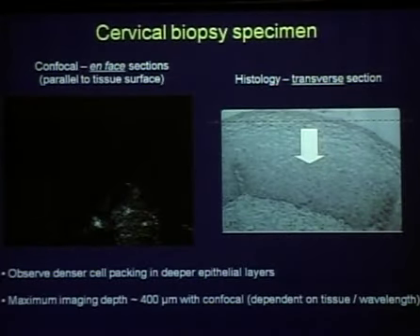Because there's melanin present in the skin, we see this particular pattern of contrast. When we look at an amelanotic epithelium, such as the oral cavity, instead what we see is that the nuclei appear bright and the cytoplasm appears dark.